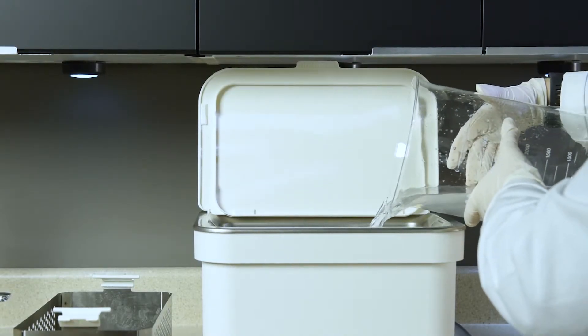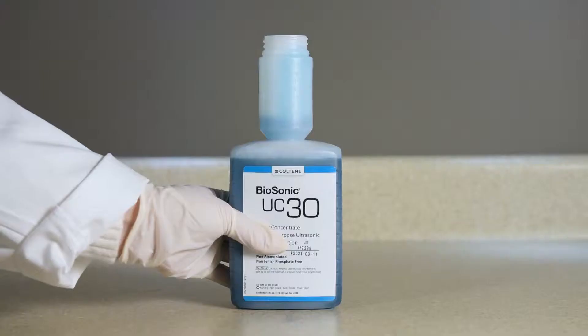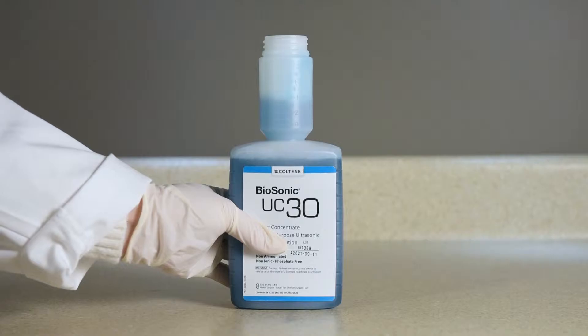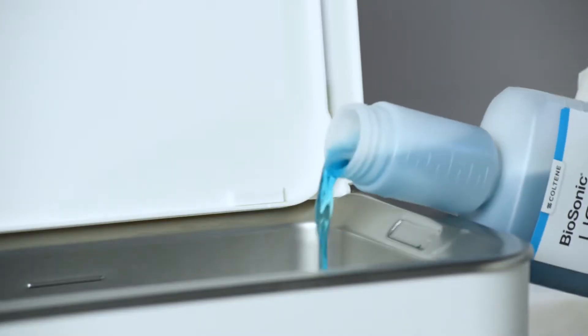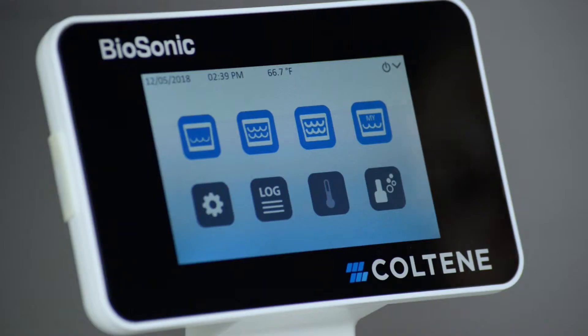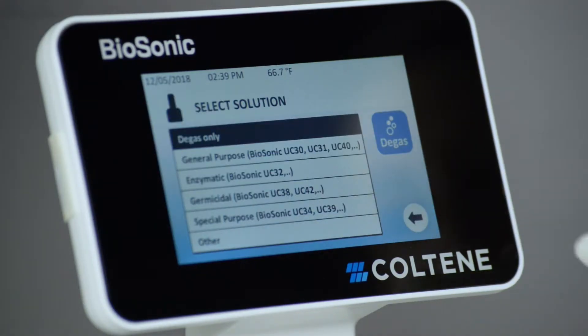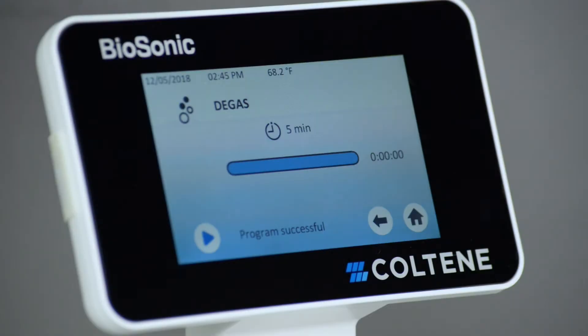First, fill your UC150 with water. Prepare the solution as you would normally to clean your instruments. Add the recommended amount of Biosonic solution from its convenient meter dose bottle, or follow the manufacturer's recommendation. Degas your ultrasonic cleaner for 5 minutes. Your unit will shut off automatically when the degas cycle is complete.